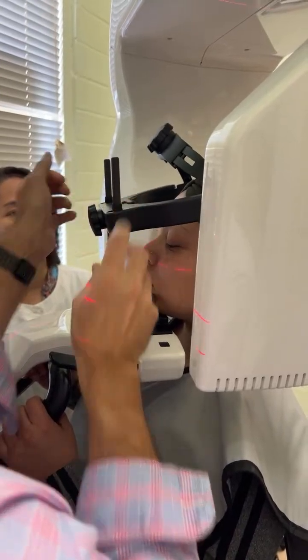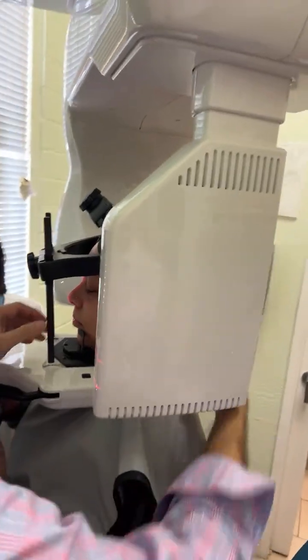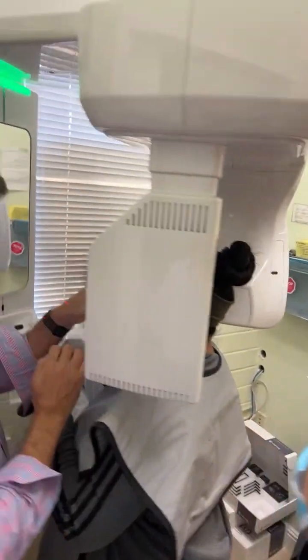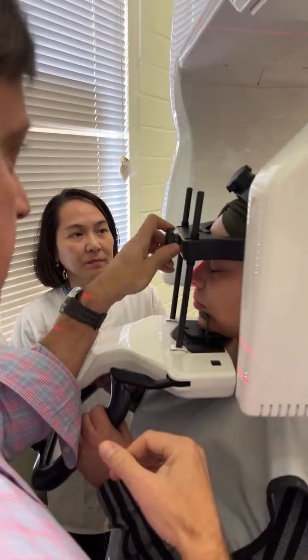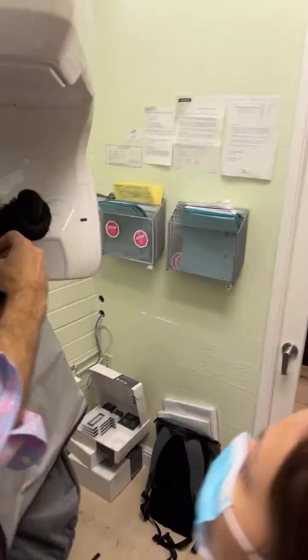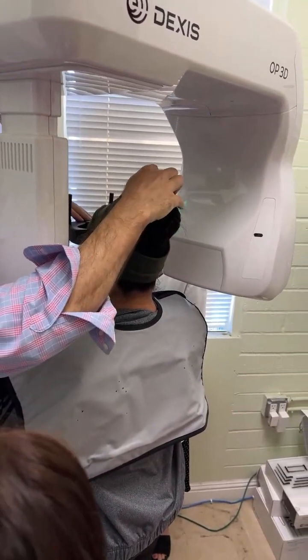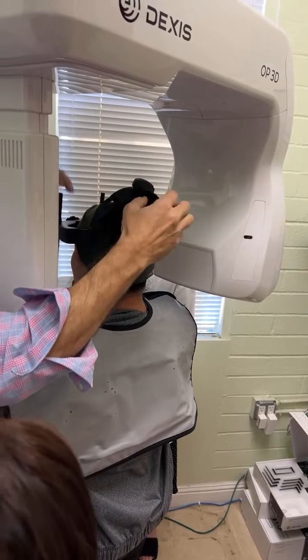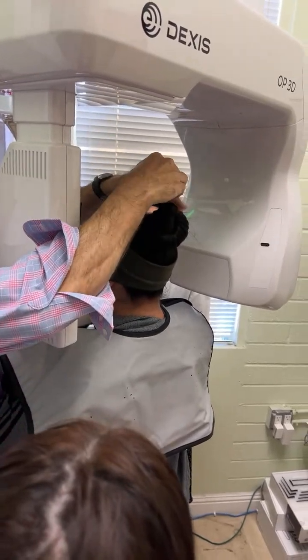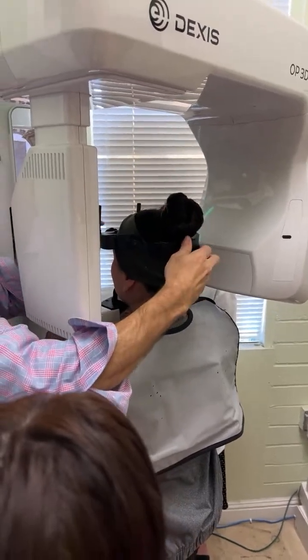Lowering this. See that? Touching. Blocking. Squeezing. See the hair bun? That's going to be a problem for this. You don't necessarily need to do it, but if you'd like, I could probably do this. Let's see. There we go. You okay?